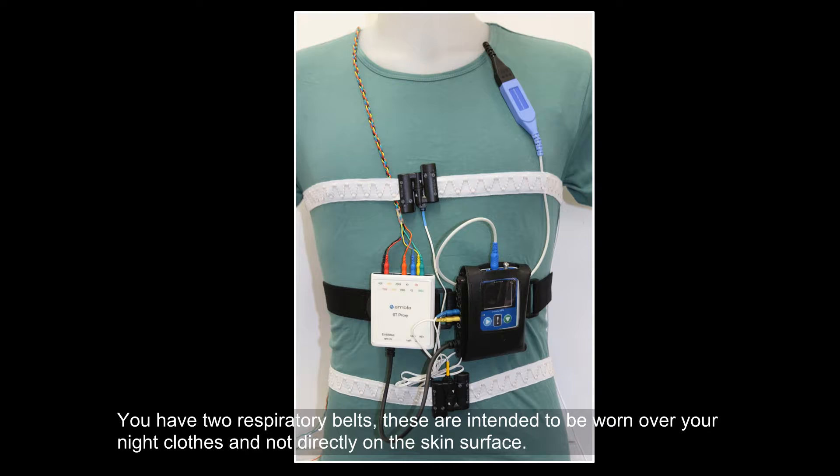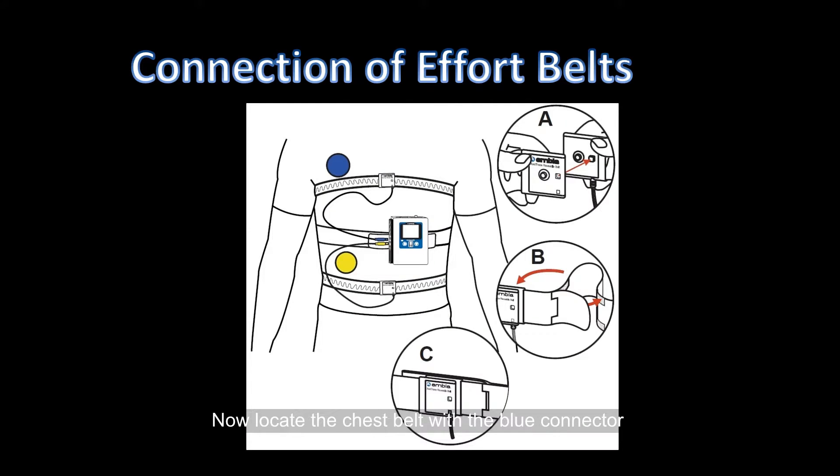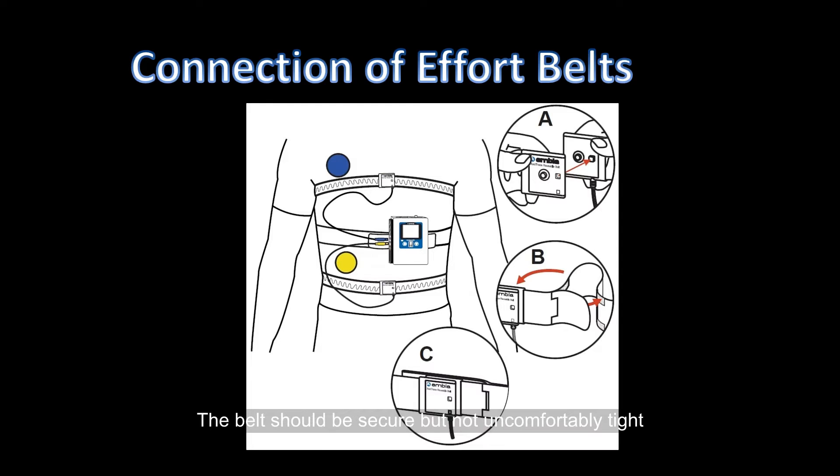You have two respiratory belts. These are intended to be worn over your night clothes and not directly on the skin surface. Now locate the chest belt with the blue connector. Place this strap with the label connection facing away from the body, around the chest above your breast area. The belt should be secure but not uncomfortably tight.